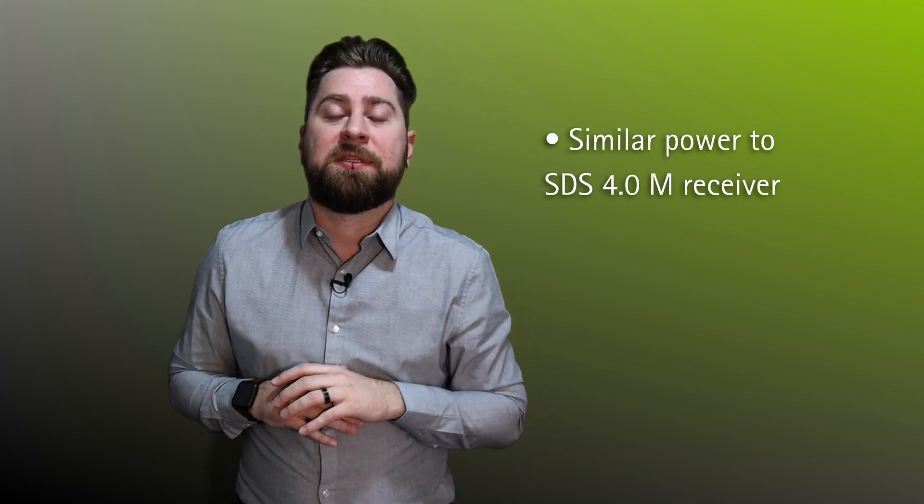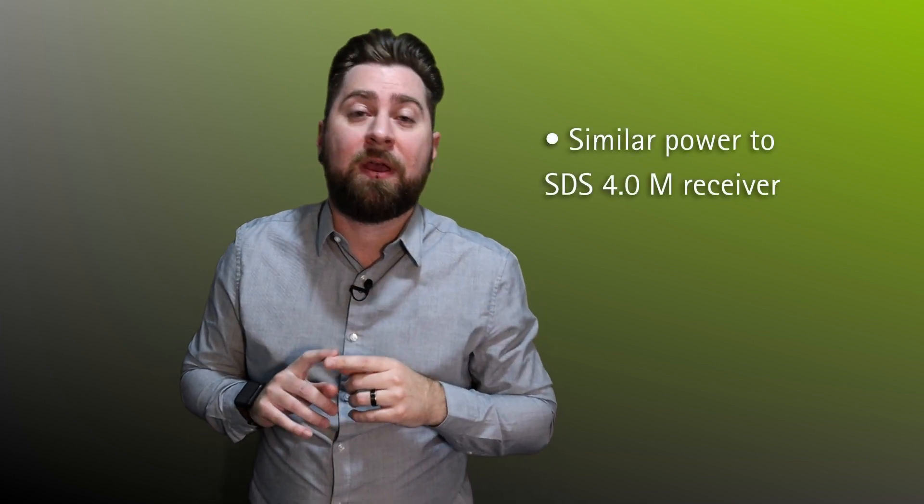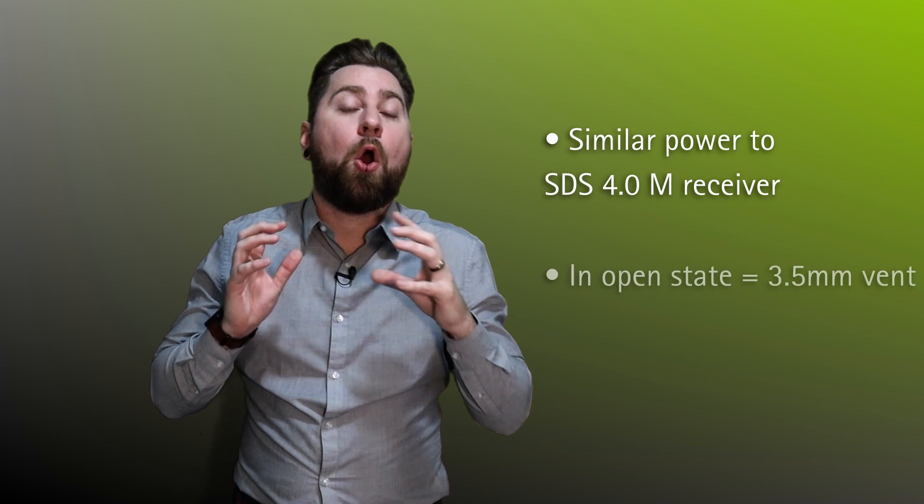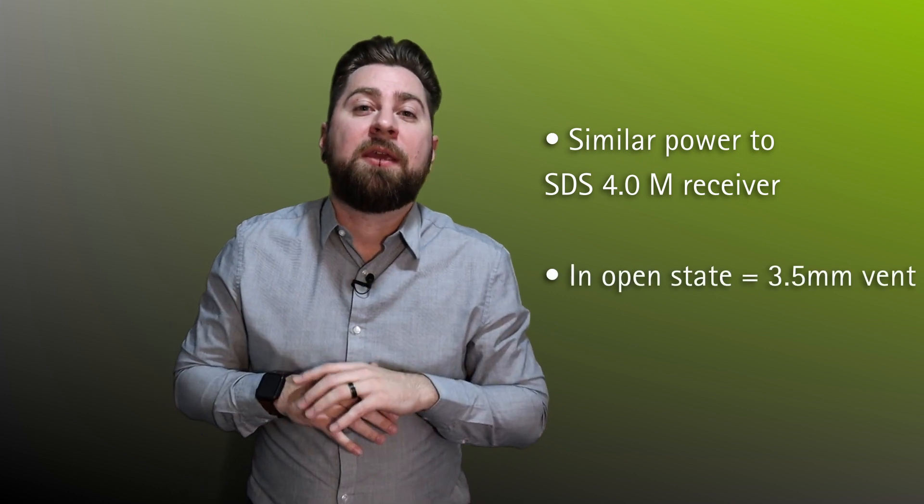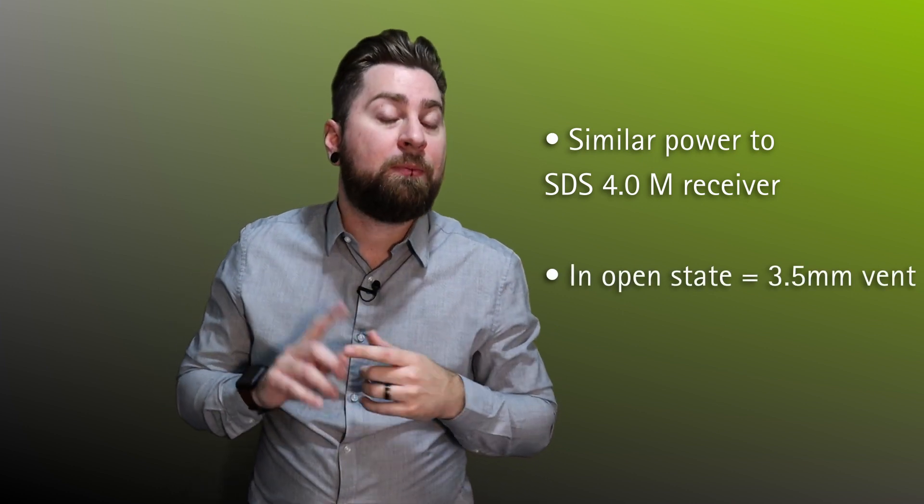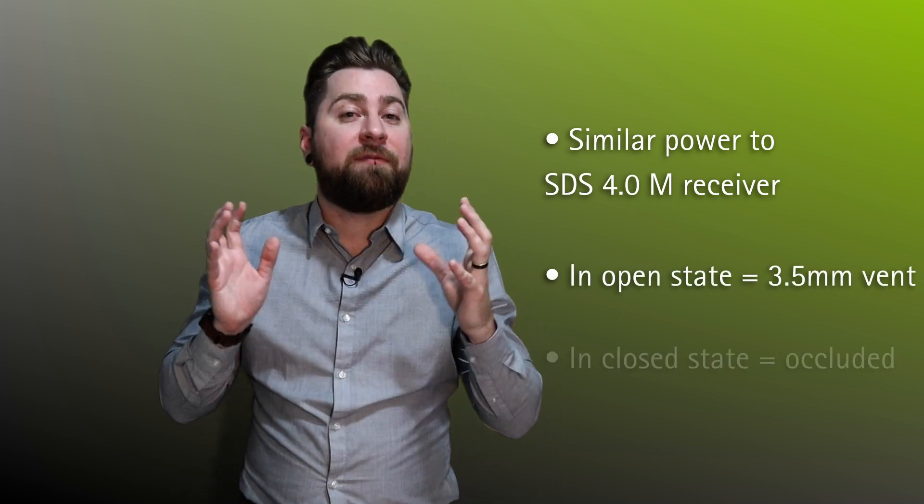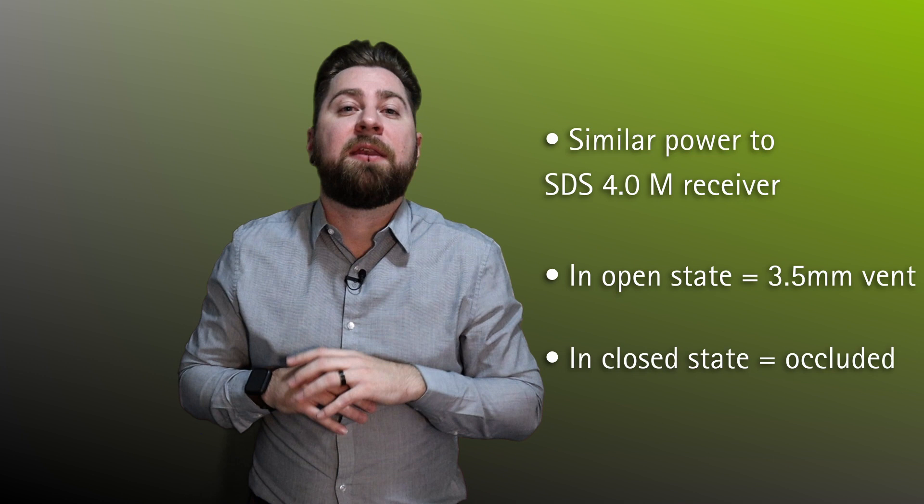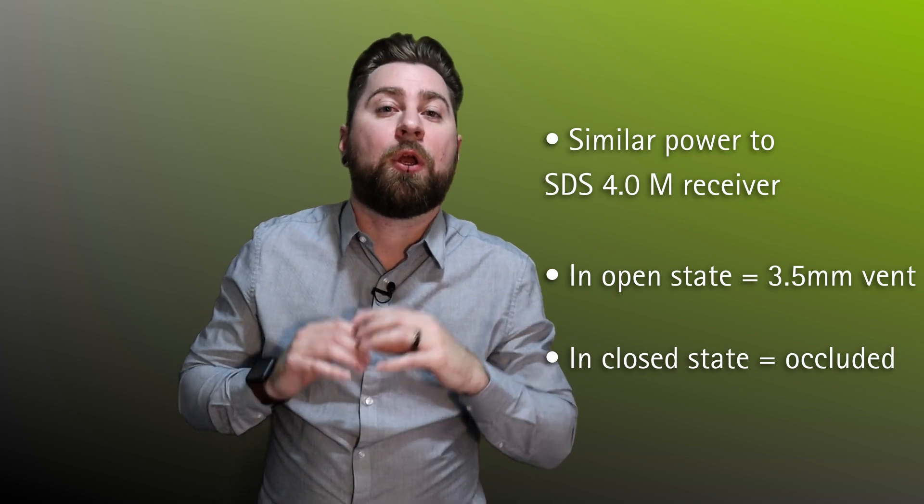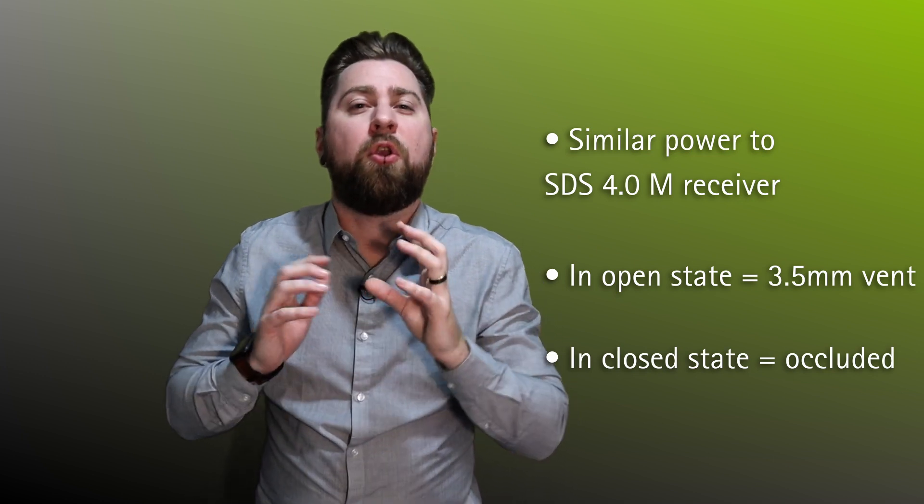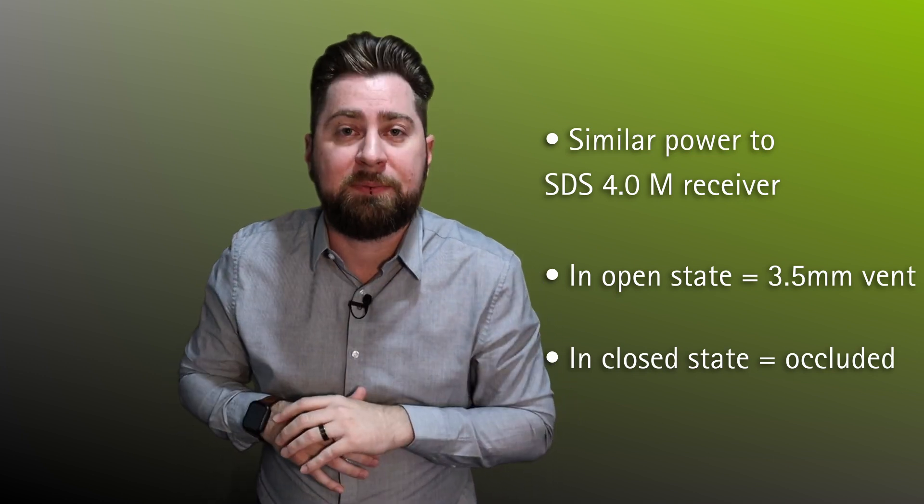As you can see from the movie, the ActiveVent receiver has a two-state vent. In one position, it creates open vent acoustics, but then as the vent closes off, it creates closed vent acoustics. The ActiveVent receiver has similar power characteristics to our existing M receiver, and in the open position is equivalent to a 3.5mm vent. When the vent closes off, it is equivalent to an occluded or non-vented slim tip.